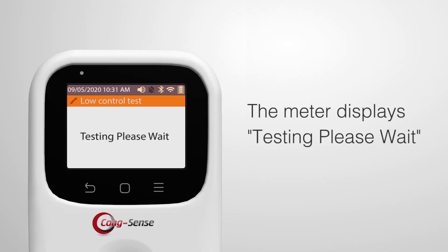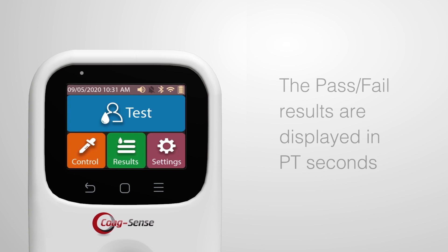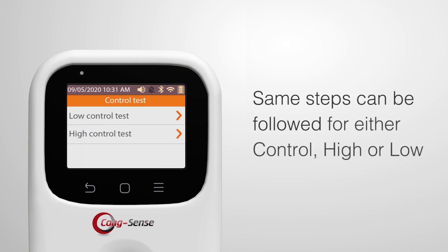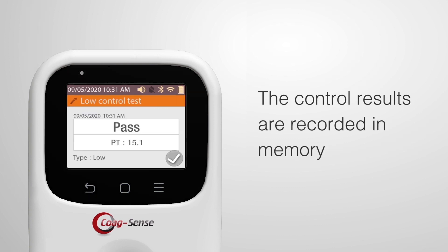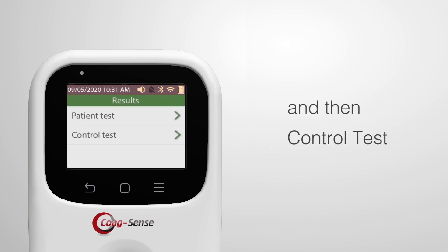Depress the Black Plunger completely to dispense the activation solution. When the control activation solution is properly applied and detected, the flashing green light will turn off and the meter displays 'Testing Please Wait.' When testing is complete, the pass or fail results are displayed in PT seconds. The same steps can be followed for either Control High or Low. The control result is recorded in memory and can be found on the main menu using Results and then Control Test.